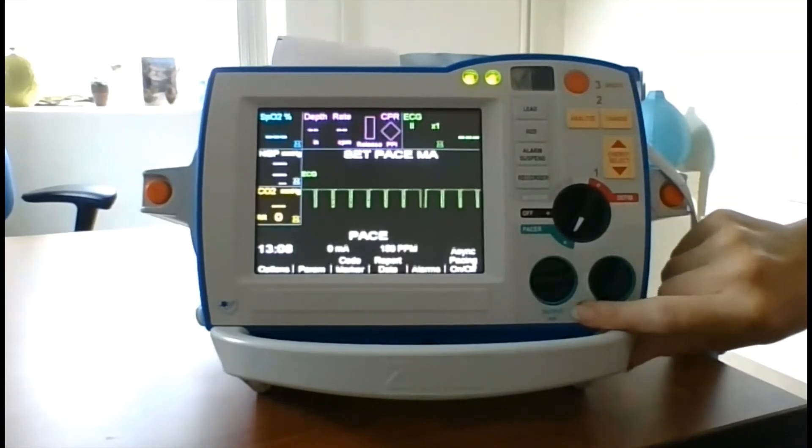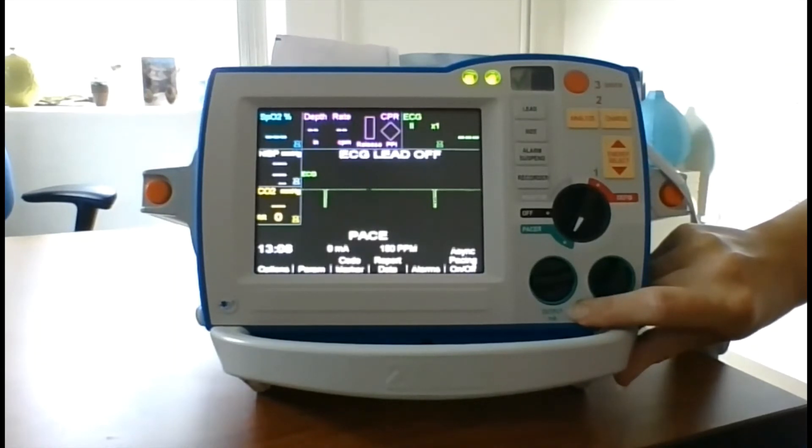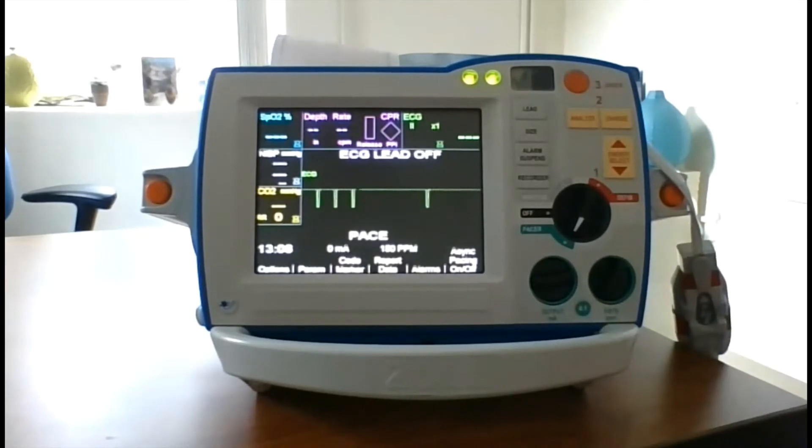Next, press and hold the 4 to 1 button. The frequency of the pacing stimulus markers should decrease, occurring approximately every 4 centimeters. You can press the recorder to stop printing.